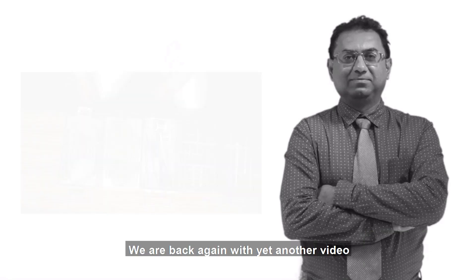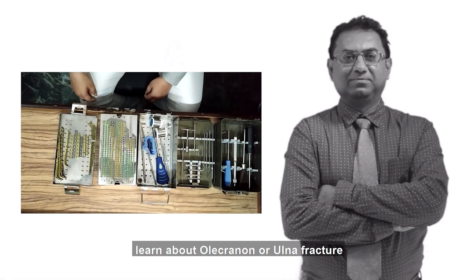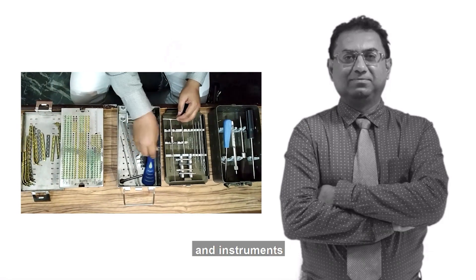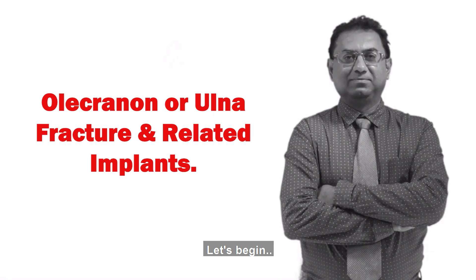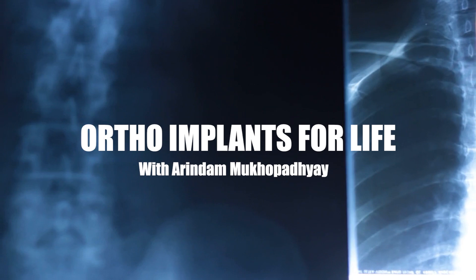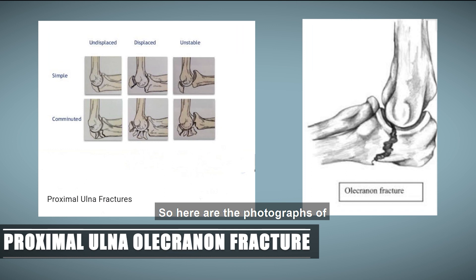Hello everyone, we are back again with yet another video. Today we are going to learn about olecranon or ulnar fracture, and what are the implants and instruments required for the surgery in detail. Here are the photographs of proximal ulnar olecranon fractures.